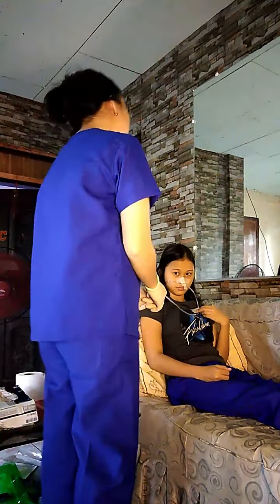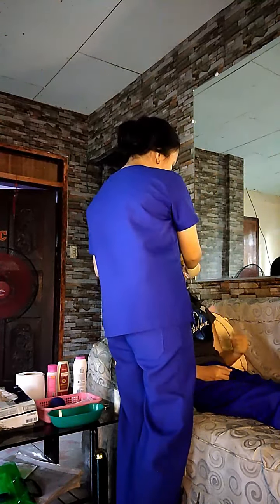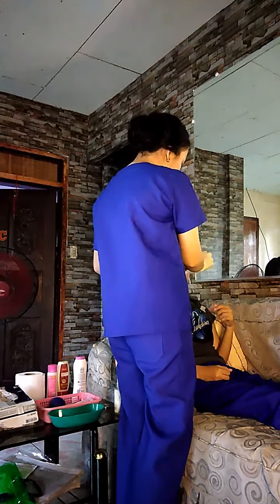I will now proceed to the doctor's order to remove the NGT. So, I will first remove its attachment to the patient's clothes. And then, remove the micropore tape.